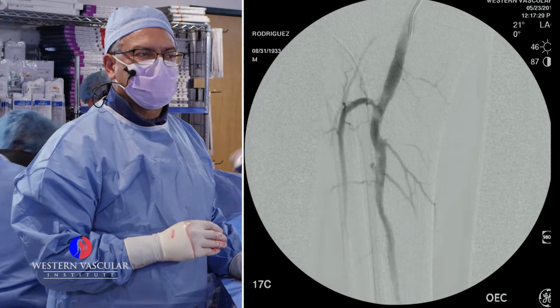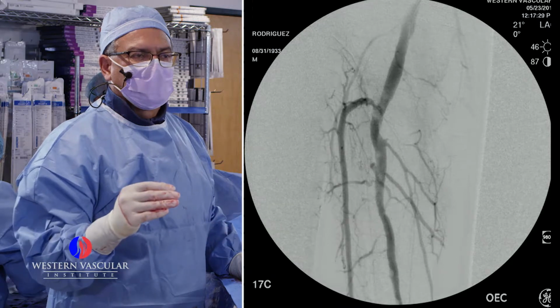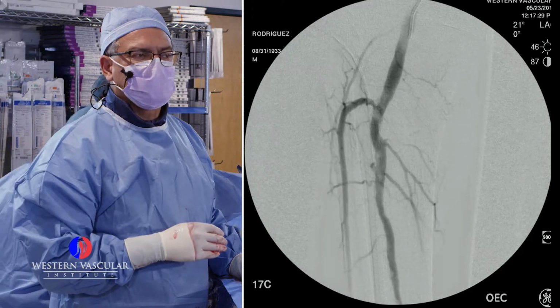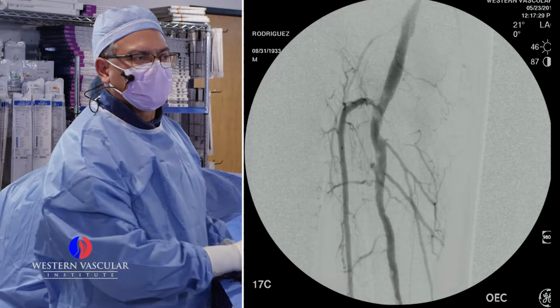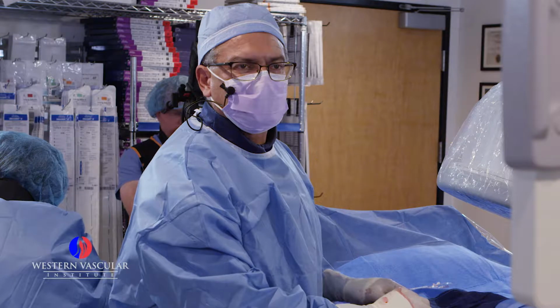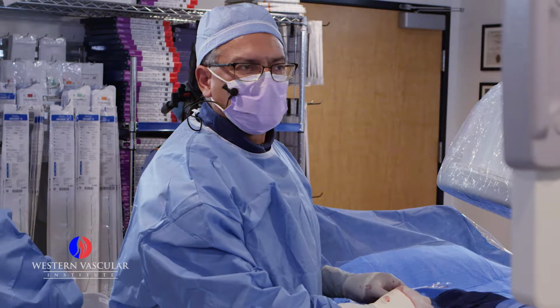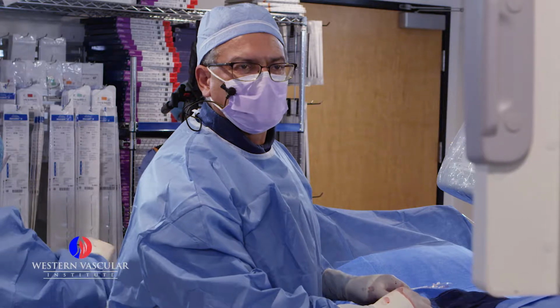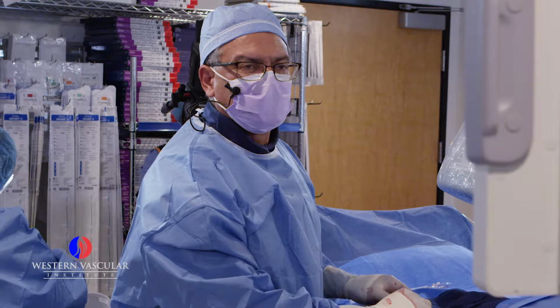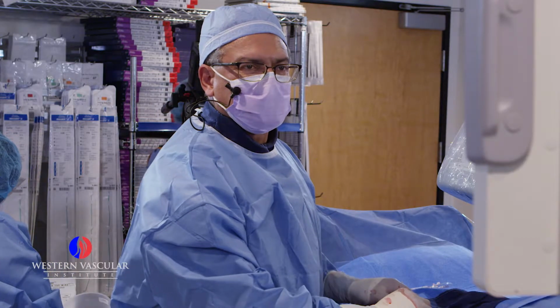I think he has missing one of them, the one that goes into the right side of the screen is gone, but he has a good middle branch and the outside branch. They're good caliber, they're good. Many ulcers in the foot, they don't heal just because the flow that is coming from above is not good enough. It doesn't contain the amount of oxygen needed to create the wound healing process.